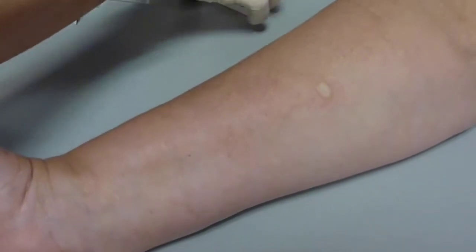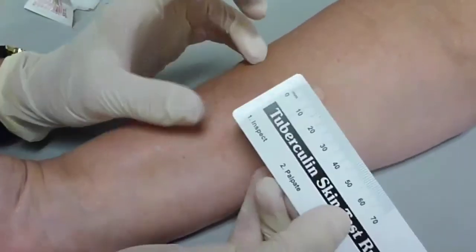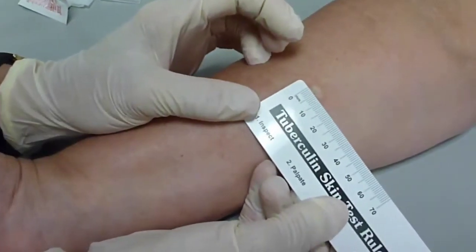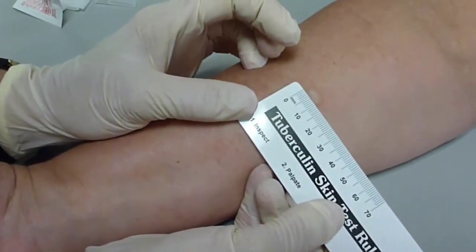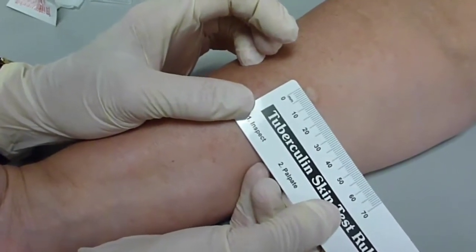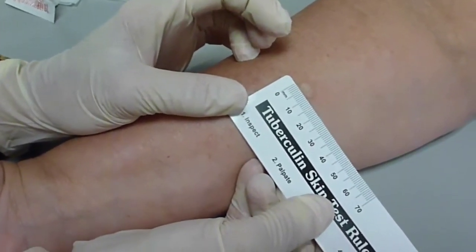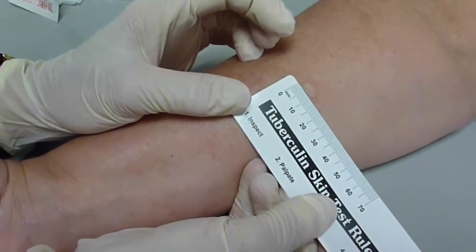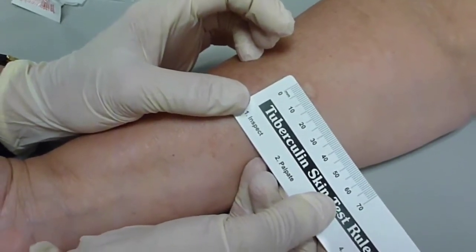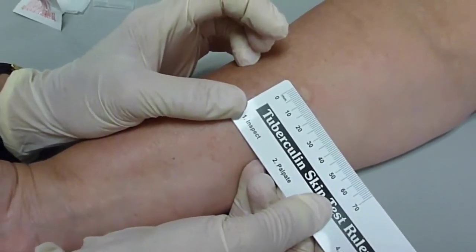Once you've placed your wheal, you're going to take your CDC ruler and measure your wheal to make sure it's between 6 to 10, which this one is at 10, so that is considered a valid test. If it's below 6 or greater than 10, or there's no wheal at all, then it is invalid and you would have to re-place the test.